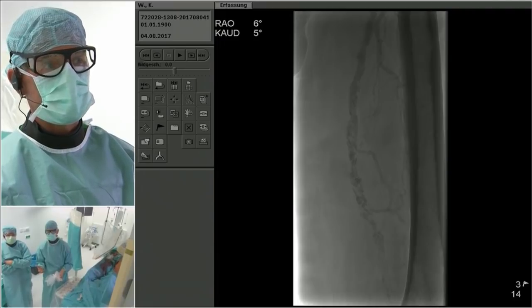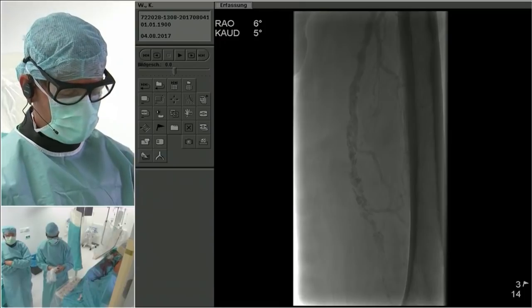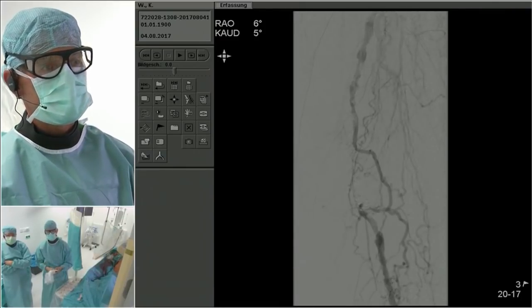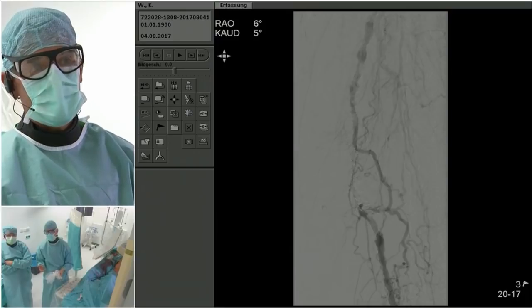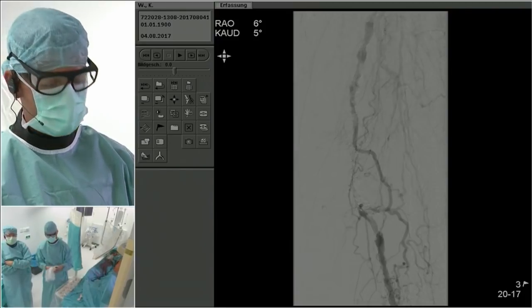It will always be around that plug, subintimal or in the media. And with the calcification also distal to the occlusion, there will be very many difficulties to re-enter distally. So we very much anticipate that this is a case where we have to go through from both sides.